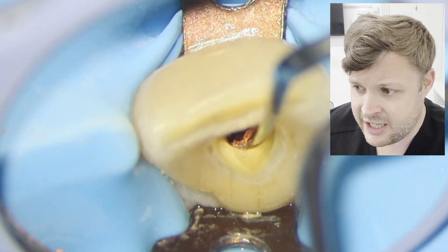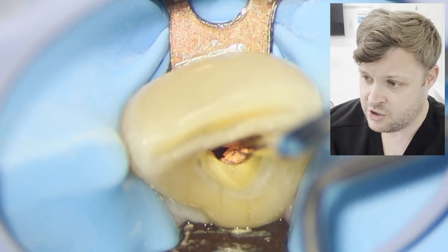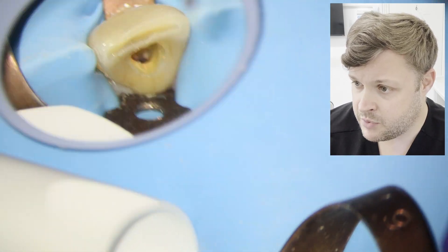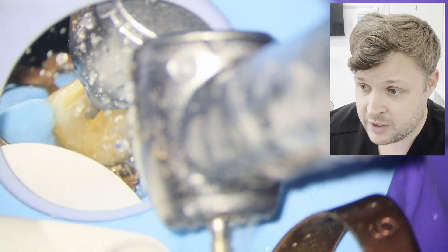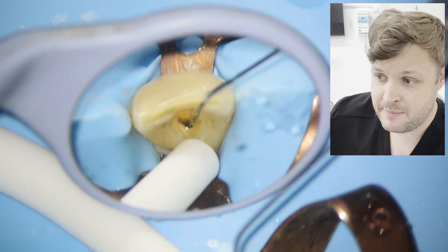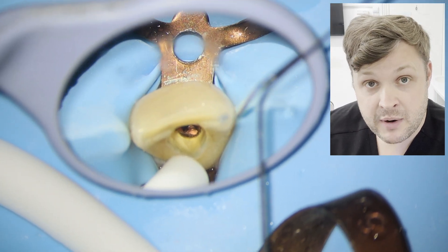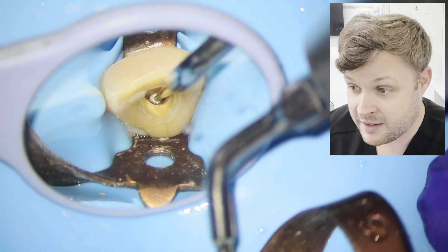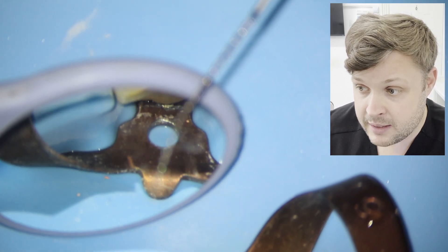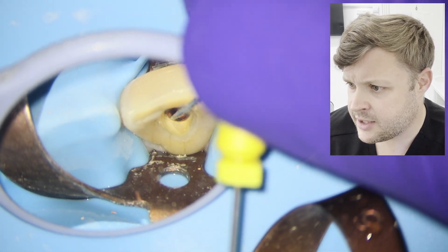I'm having a slight issue with straight line access here — the GP is adhered to the palatal aspect of the canal wall. Unusually, what I've done is removed the buccal aspect of the prep, which has given me a bit more straight line access so I can pull the GP out more. Lots of irrigation as well, because you'd be surprised how much GP is removed with irrigation. I'm also using an ultrasonic tip to remove that palatal shelf.